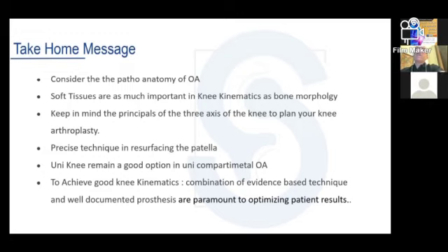It depends on the amount of deformity of the rheumatoid arthritis, because some people come early, and others come very late with very poor bone stock and very inflammatory soft tissue, and in this case we use a very constrained knee. We use the Zimmer one with the big cam in the middle, if there is no peripheral laxity. But if there is damage to the lateral collateral ligament or the posterolateral corner, it will be a very constraining knee.